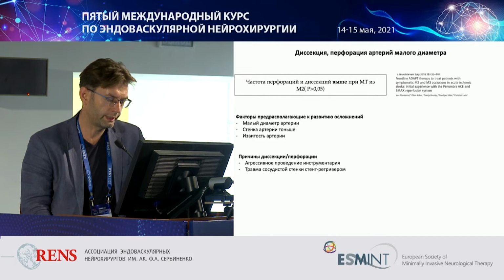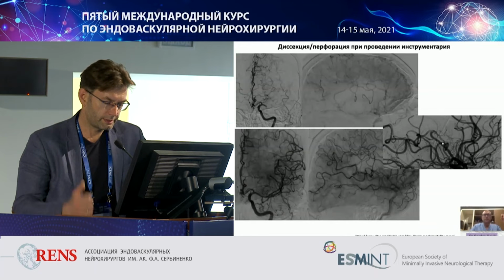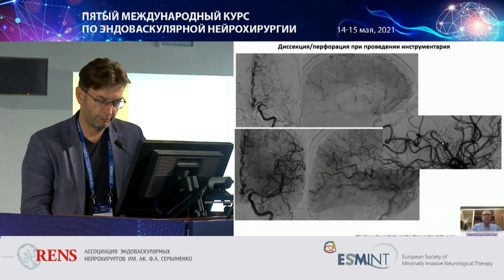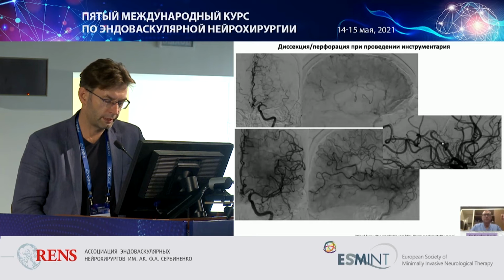artery. This is due to anatomical factors, thin walls, and according to the literature, such complications occur more often than in the case of mechanical thrombectomy from the M1 segment. Such complications we didn't observe. So what I demonstrate here is the experience of our foreign colleagues who brought us their webinars last year.